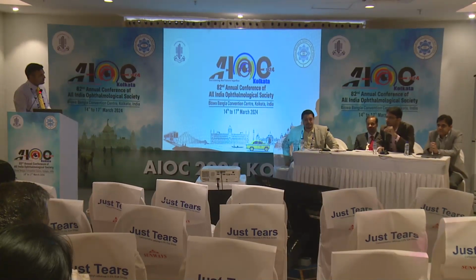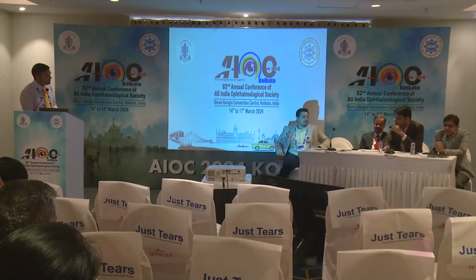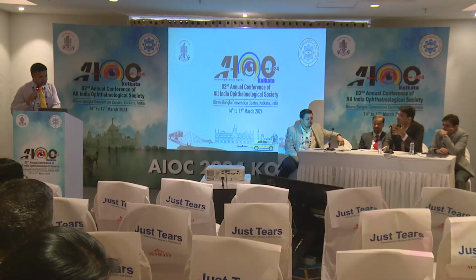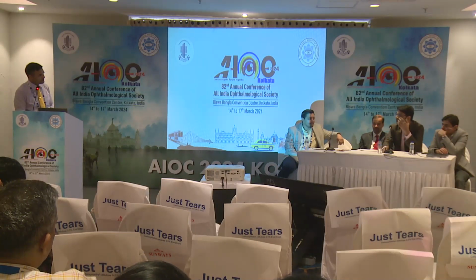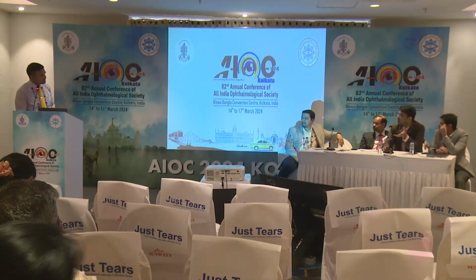Anyone from the audience want to ask, or else I'll go for the question. Okay, so Dr. Pradeep, you have beautifully highlighted the role of the upcoming advances in wide field OCT angiography systems. But since Dr. Vinod sir had also mentioned that if we have to look at the microaneurysms at the macula, we consider a 3 mm scan rather than a 6 mm scan because the resolution falls down significantly. So although we'll be able to capture a larger area, that is good, but if we want to see predominant peripheral lesions, that may not always be a neovascularization, but could even be the microaneurysms. So definitely we are going to miss them. What is your take on that?